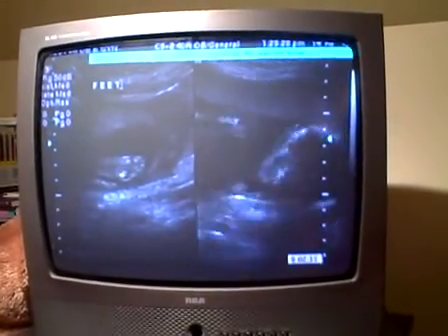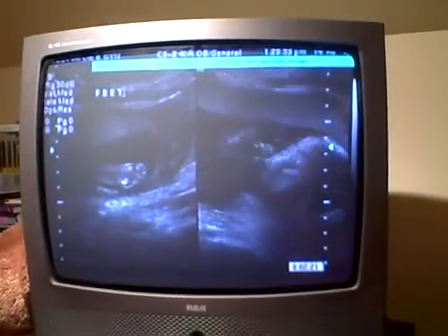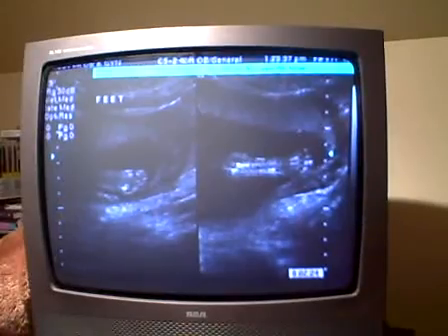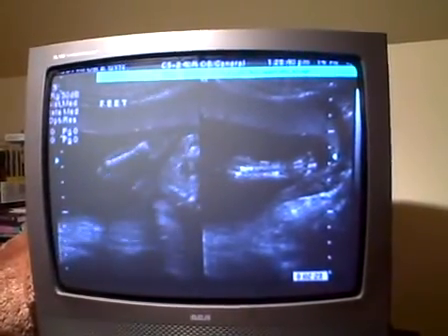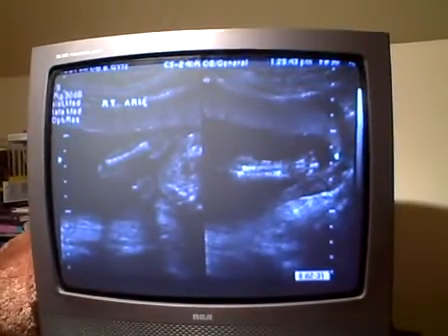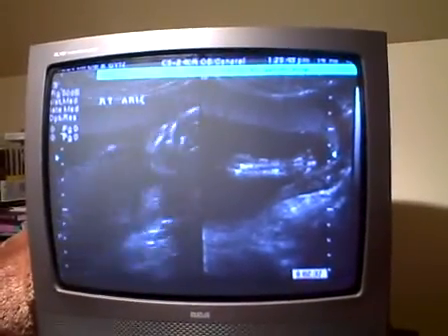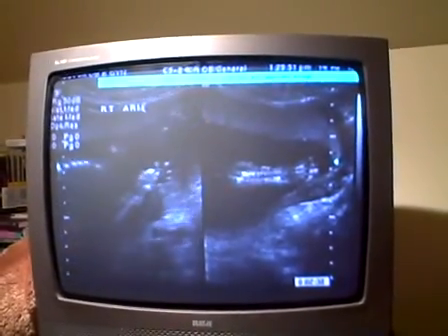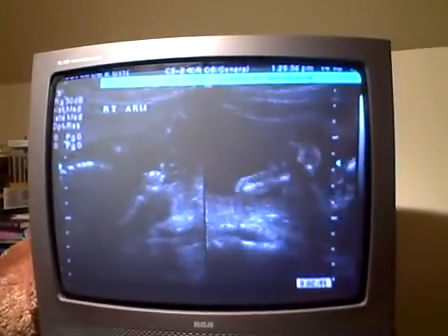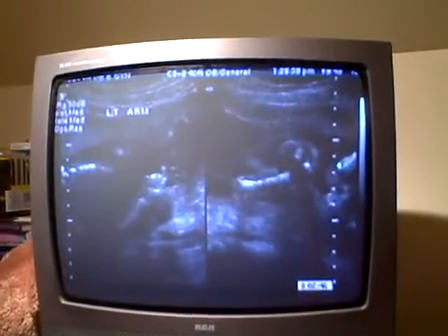There's an arm. Head. And the arm is moving toward the head. There's the arm — you can see the fingers and the arm bones. She froze that one. Now she's on the left, and we've got a fight-the-power arm going on on the right. There's the spine briefly. You can see that. And the face. There's a hand on the left, and now she's going to look for the other hand. And there it is. So we've got a couple hand things going on there.